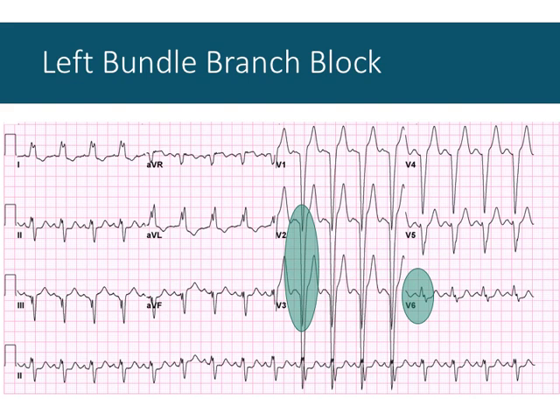You don't all have to do the 12-lead ECG. But you might want to prepare the area for electrode placement before you get there and practice landmarking on yourself to figure out, okay, well, I can get it in the V1 spot, I can get the V6 spot, no problem. Try to figure out where your intercostal spaces are. You might want to do a bit of advanced preparation before lab this Thursday. And I tell you that now because if I tell you on Thursday morning, maybe it's too late. Maybe not. Maybe you go home in the middle of the day. But something to consider before you get to lab.